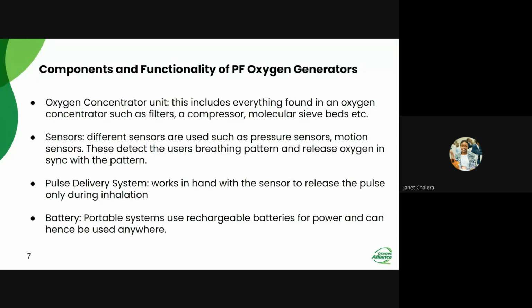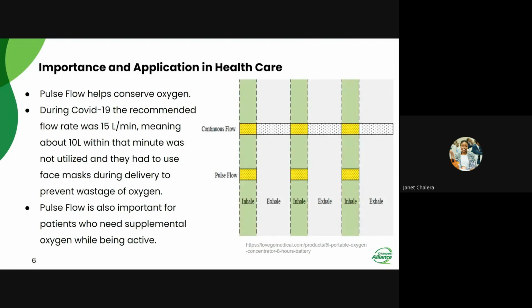Just a brief explanation even on the conservation part. Can I have the previous slide? During COVID-19, the flow rate being given to patients was actually 15 liters per minute. But let me just explain something else before I explain that.